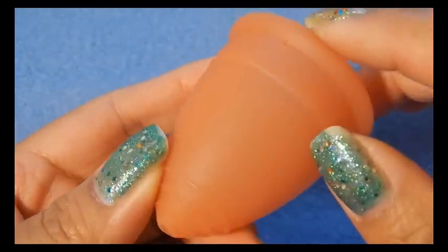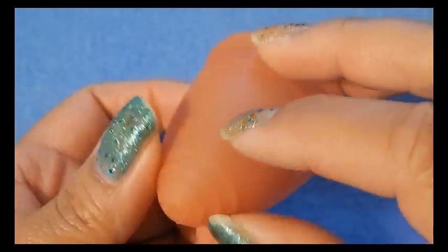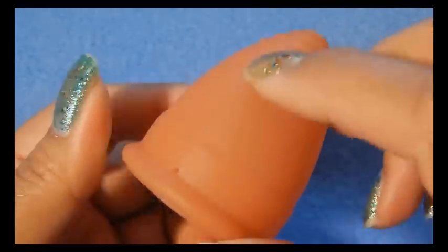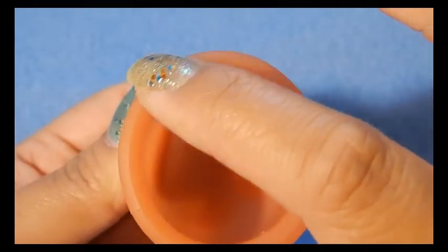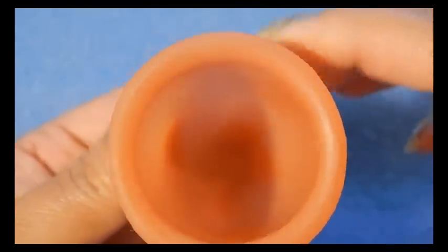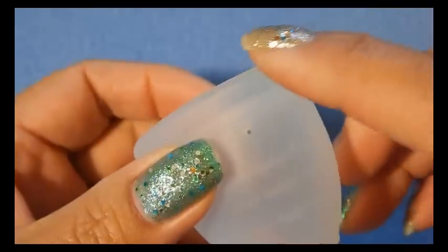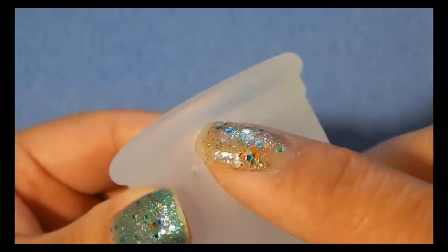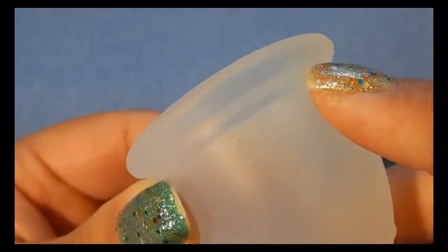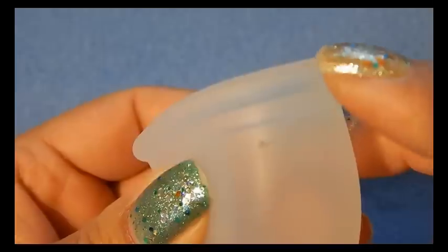The Lunette has a seam that runs all the way down one side of the cup, up and around the stem, and back down the other side. It also has a seam right on the very top of the rim that goes all the way around. The Ruby cup was molded in one piece and there is a seam right on the rim but on the side of the rim. They did pretty well minimizing the seams on the Ruby cup.